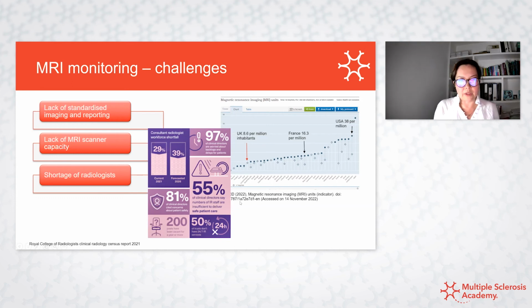So we've done our best to try and tailor. For MR capacity, we do the minimum. For follow-up, we really do very quick, slick scans so that they're short examinations. I know we do the cord, but we really only do 3D FLAIR, DWI, and a cord. So they're quick scans. We try and minimize MRI time, but these are real physical challenges that we face.